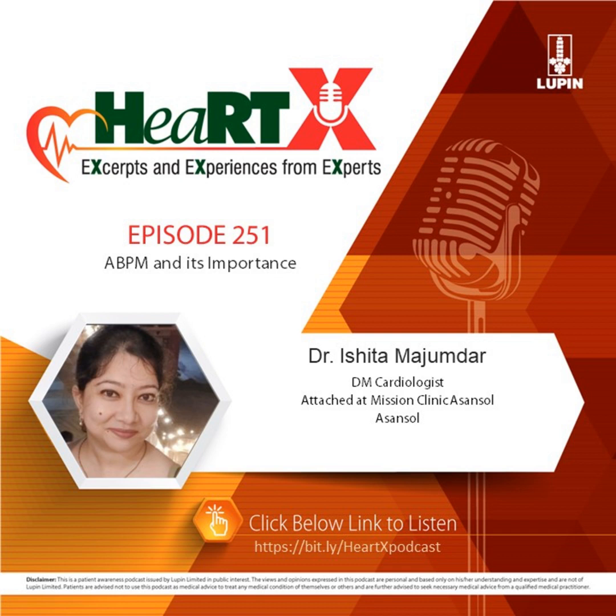So what are the disadvantages? It is expensive and sometimes of limited availability. It can be uncomfortable as it has to be worn throughout the day.